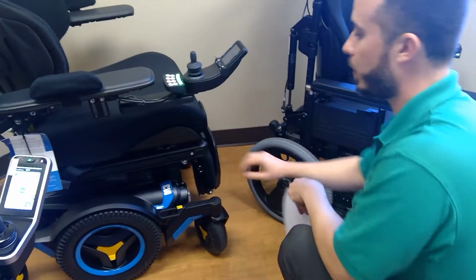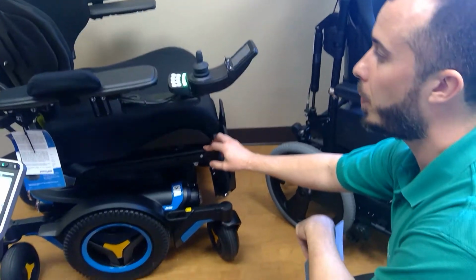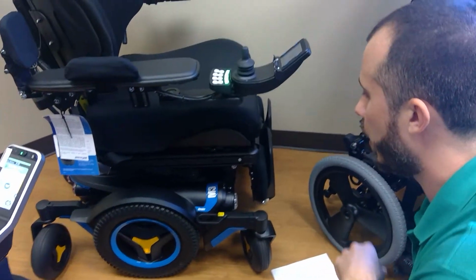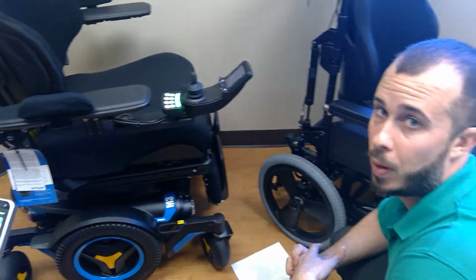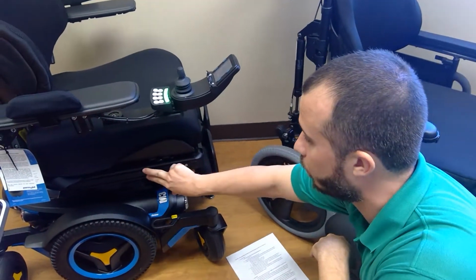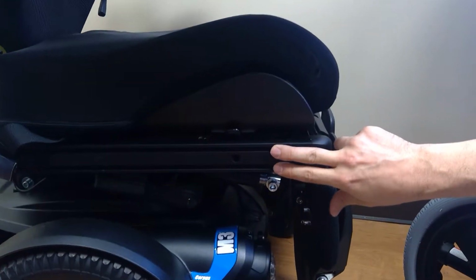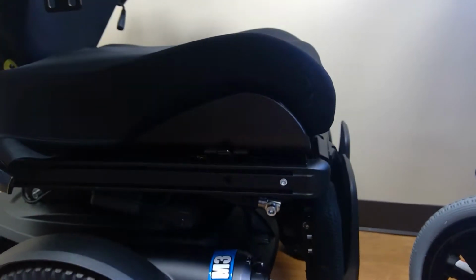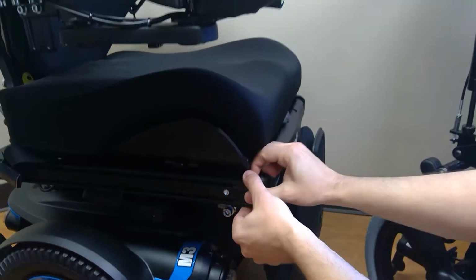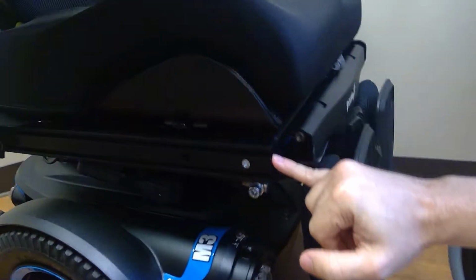So we have a Permobil chair here. This is the Corpus M3. And Permobil is actually pretty straightforward when it comes to choosing a mount fastener, because almost all of the new Permobil chairs use the Unitrack, right? So you're going to see these two tracks right here. This is where we're going to be mounting to. And if you want to verify that, we can kind of turn this to the side a little bit, pop this little end cap out, and you'll see that we have two individual channels there.